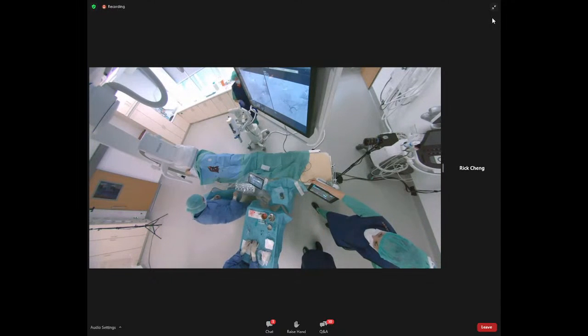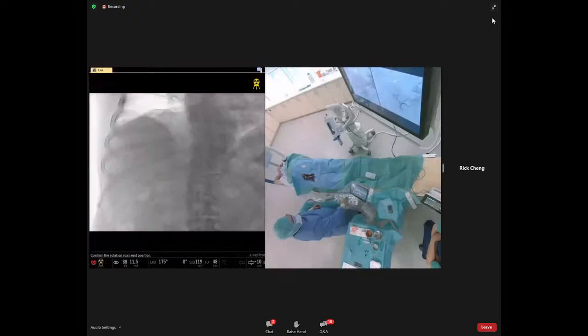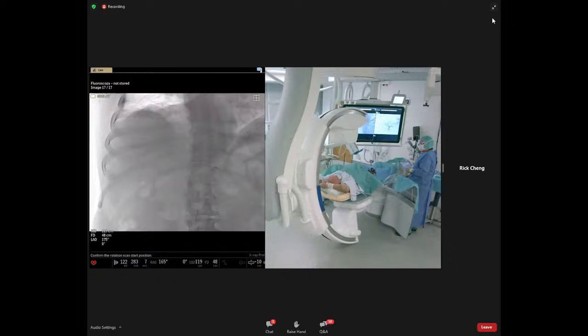The proper injector protocol is set on the power injector. The detector is rotated to the landscape position. Check in the AP position if the liver is in the region of interest by pressing the fluoroscopy foot pedal. It's important to have the liver in the center of your image, especially when you're using the cone beam CT open.